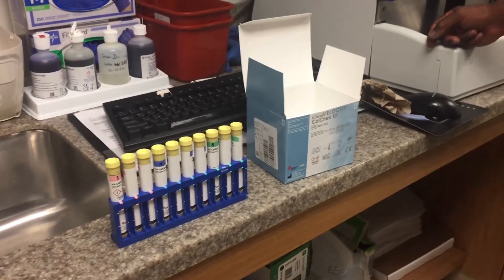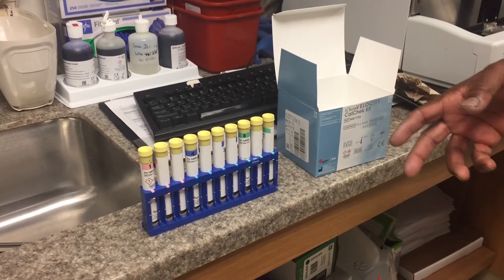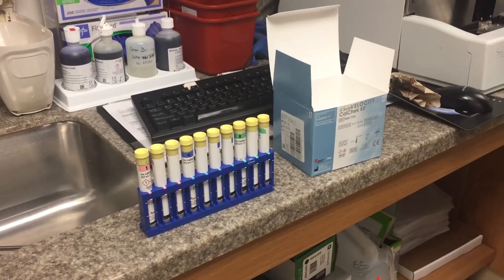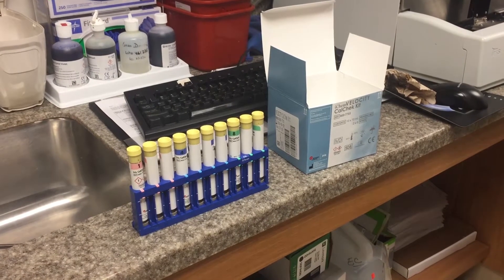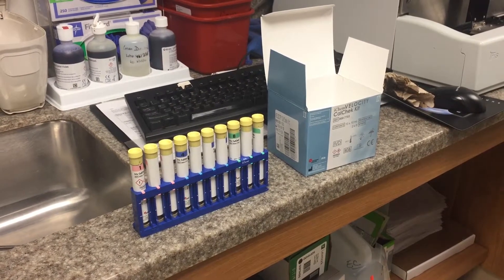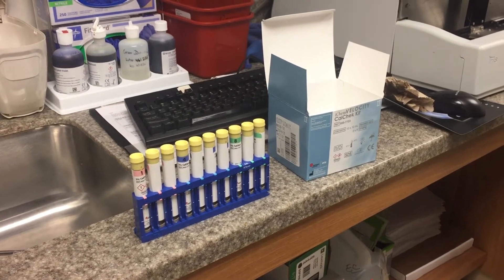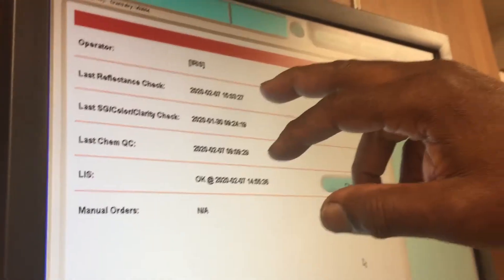So then these results — what are the results? If it passes, it's going to say pass. So why so many? It does different things — we call it dilution, different variation. They show Reflectance pass.